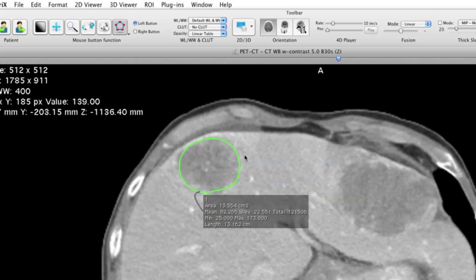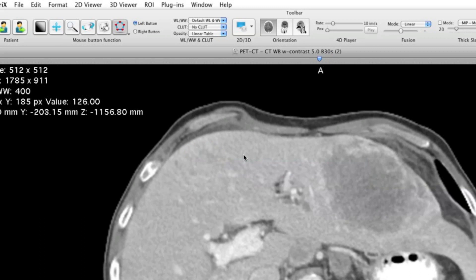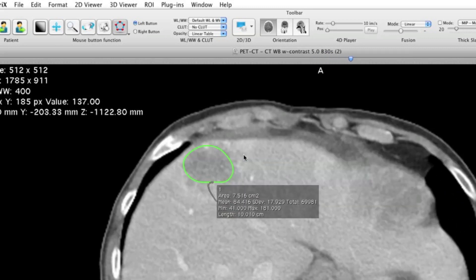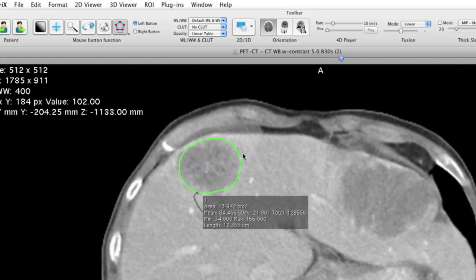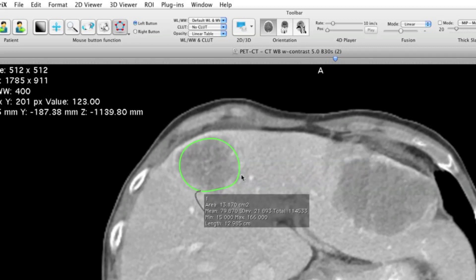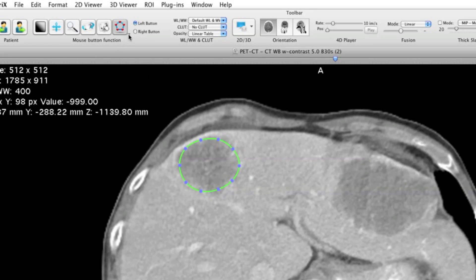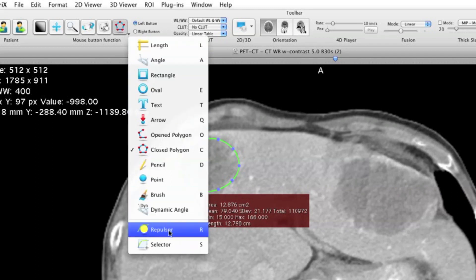OsiriX has now interpolated ROIs in all slices between the first and the last ROI drawn, marking up the lesion. If you are not satisfied with what the algorithm did, you can click on the ROI and move the control points. There is also another tool in the ROI toolbar called the repulsor tool.